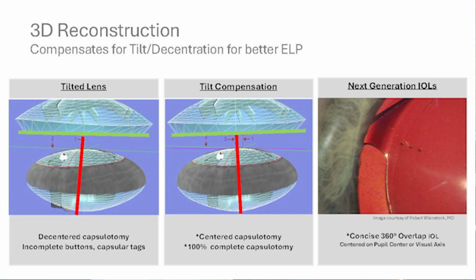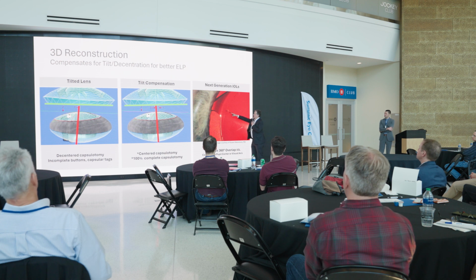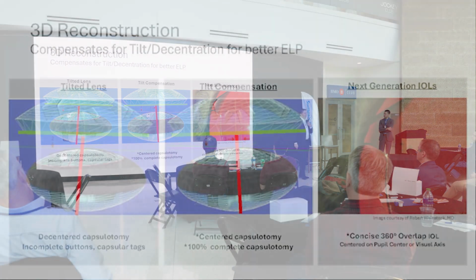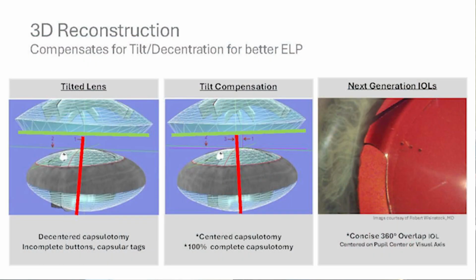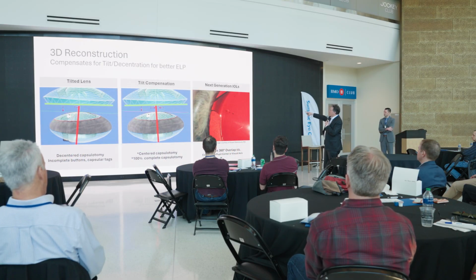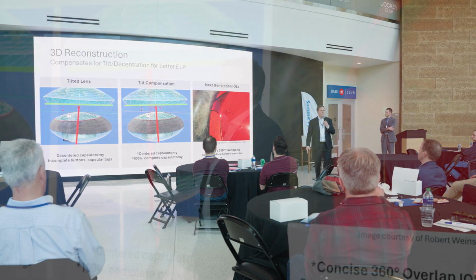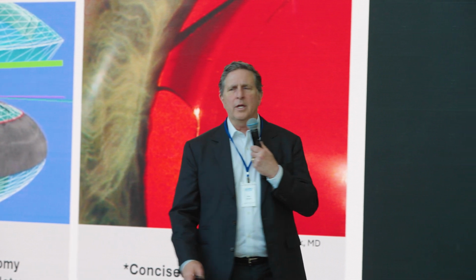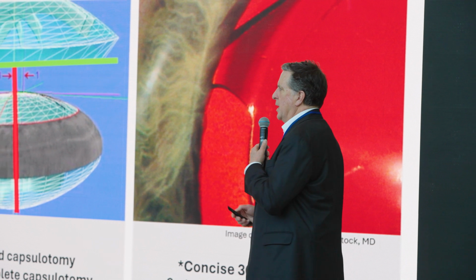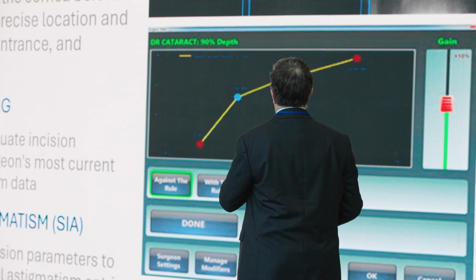So here's the 3D reconstruction. And this is maybe a little bit subtle, but all of our toric implants have these 3 dots. And if you see this little nubbin right there? It's a little bit subtle, but when you are co-managing the patients, and if an astigmatic correction has been done, you can confirm with the slit lamp. You don't have to measure and do anything other than to say, oh yeah, there's the capsular tag, and it's right in perfect alignment with the toric lens markings. So we know the lens was not only placed in the right position, but it hasn't rotated. So again, that just gives a proof positive confirmation of where we are.